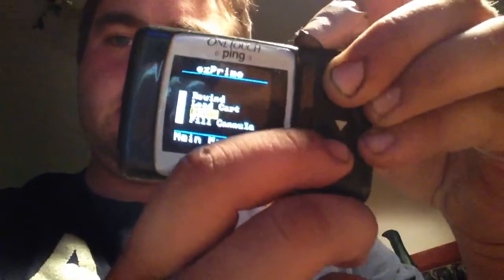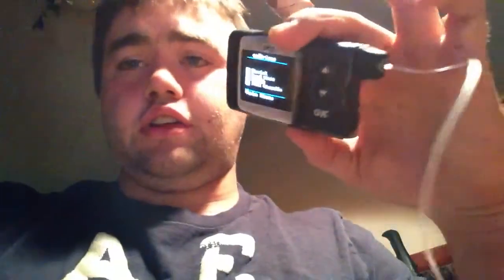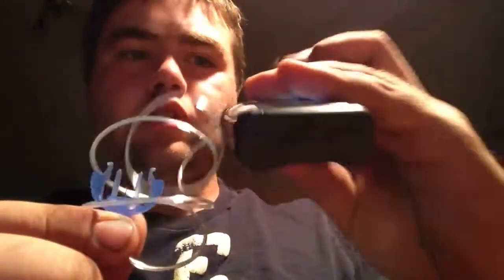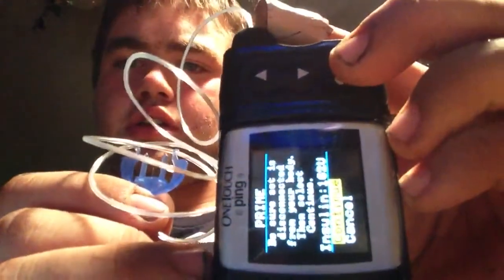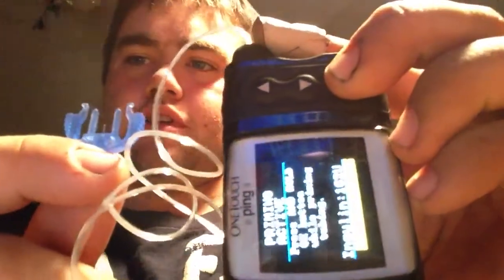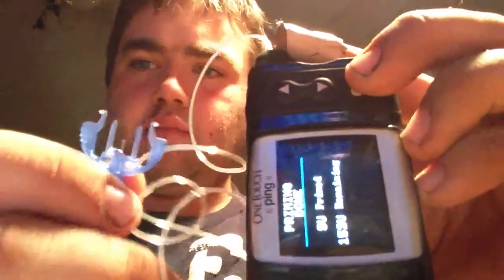Now, what I gotta do is go to prime, because I've already loaded the cartridge and rewound it earlier today when I changed the insulin. So I hold this straight up and down. I got the little tubing right here, and holding it up and down is just in case there's any bubbles inside. It just pushes them up because air floats on top of the insulin just like water. So I continue, and now it says go prime. I'm just going to hold that button until I see some insulin come out of the little needle up top here.